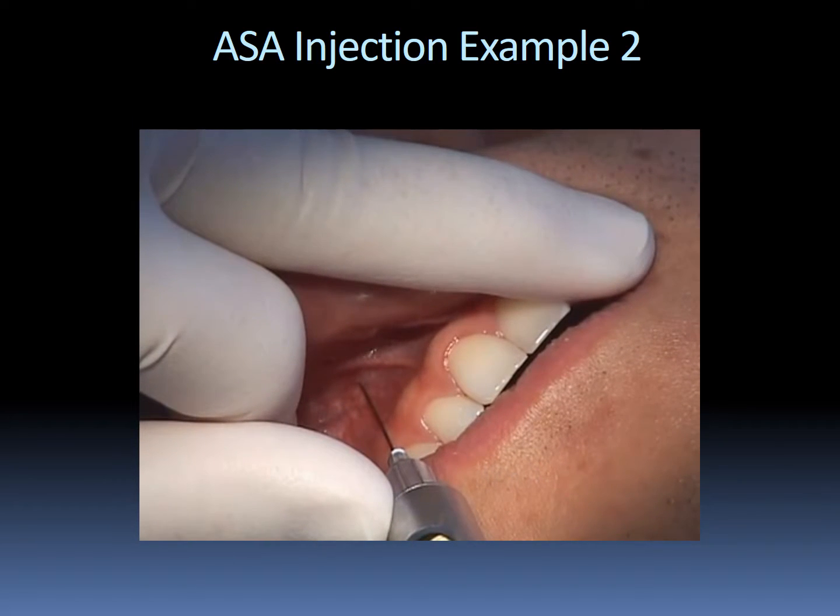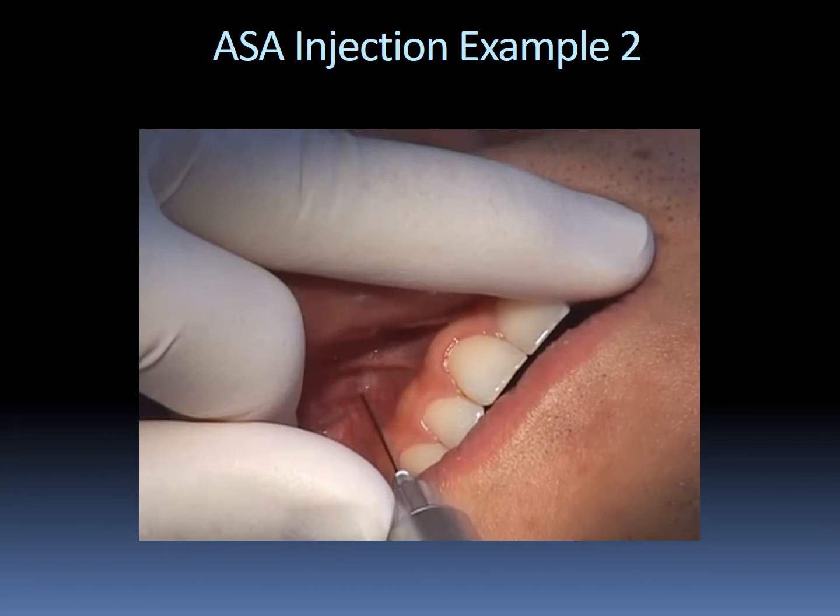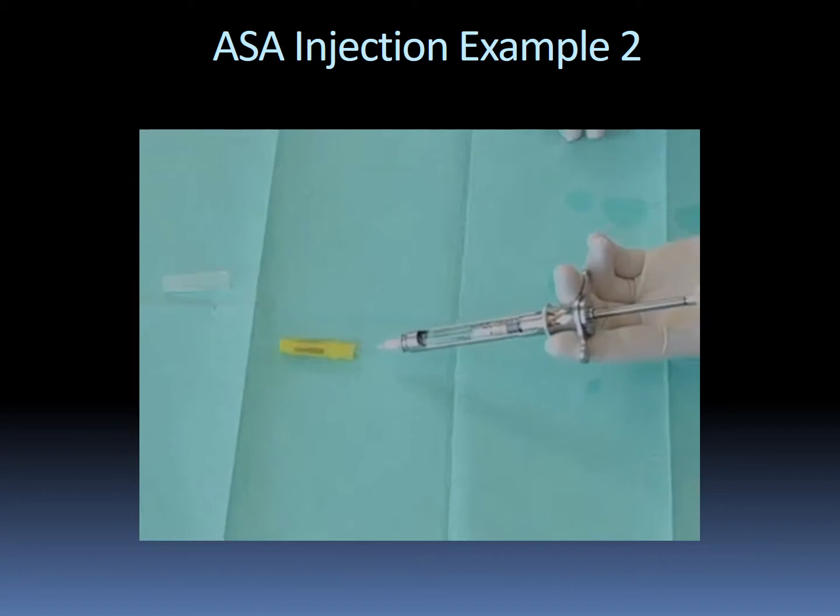Volume is determined by the individual tooth. For example, multi-rooted teeth will require more anesthetic. Volume is also affected by whether or not the client requires pulpal or soft tissue anesthesia. More anesthetic will be needed to fully penetrate a nerve and anesthetize all of its nerve fibers. An in-depth discussion of this principle can be found in many textbooks on local anesthesia. Once the solution is deposited, slowly withdraw the needle and safely recap.